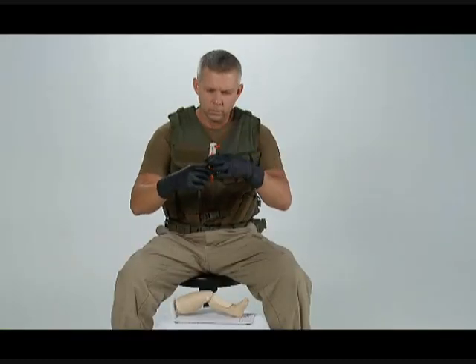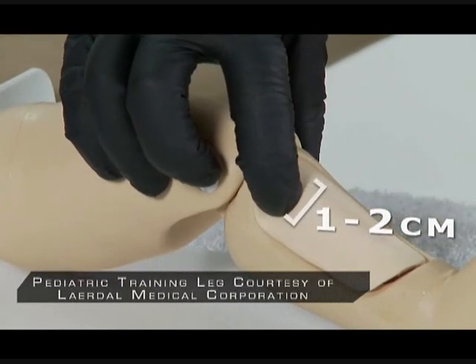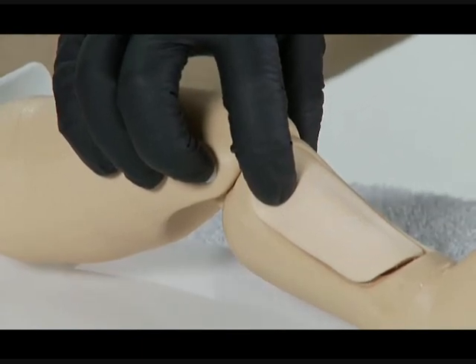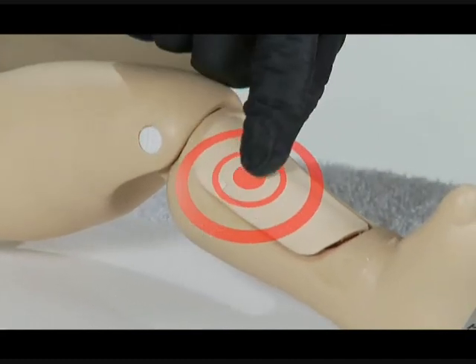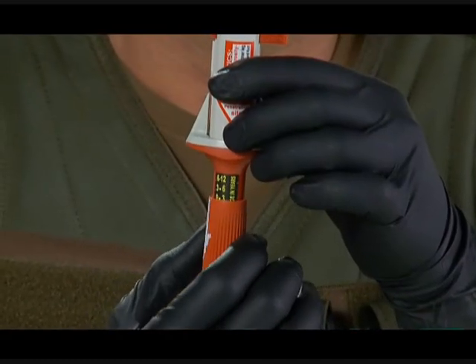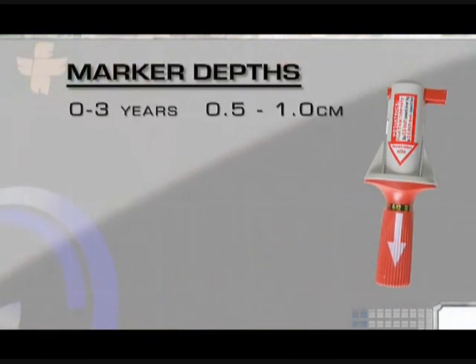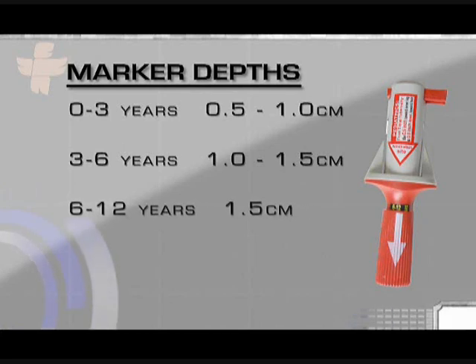For pediatric placement, find the same outset point, which is the tibial tuberosity. From the tibial tuberosity, go one to two centimeters toward the inner part of the leg to find the flat portion of bone called the tibial plateau. From the tibial plateau, go distally, or down, toward the foot, approximately one centimeter, or half an inch. Using the red barrel, adjust the BIG's penetration depth according to the patient's age. The age and depth are both marked on the device: 0 to 3 years, 0.5 to 1 centimeter; 3 to 6 years, 1 to 1.5 centimeters; 6 to 12 years, 1.5 centimeters.